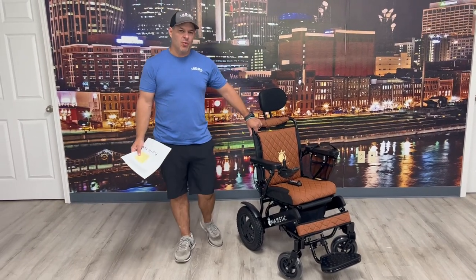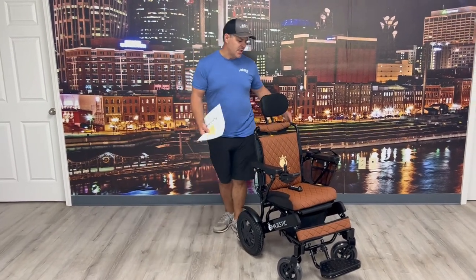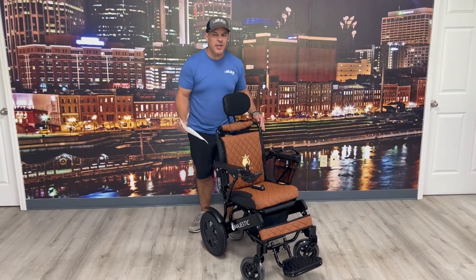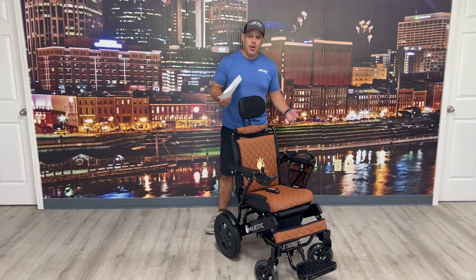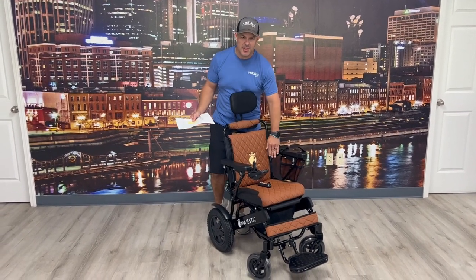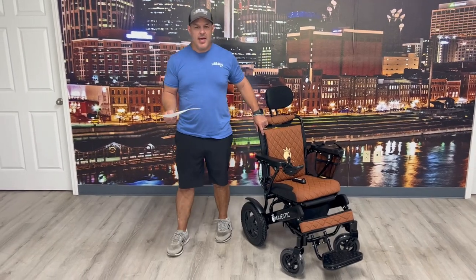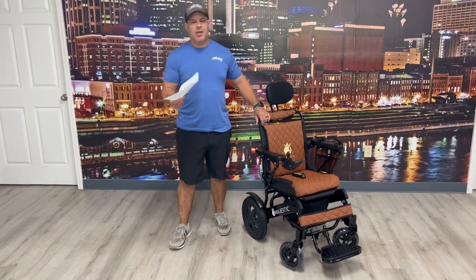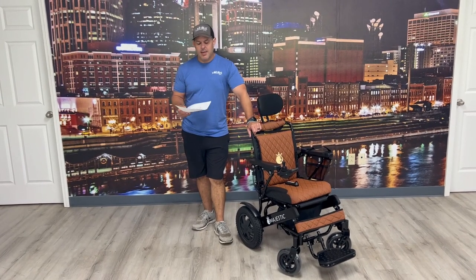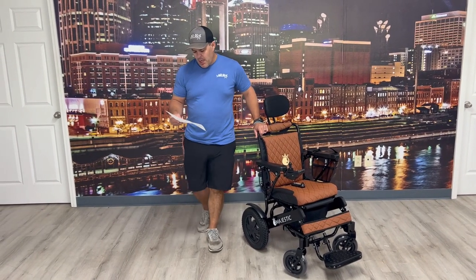The weight cap is 330 pounds. This one is a 17 and a half inch wide version; they also make one in 20 inches. I would say if you're closer to 330 pounds, you're going to want that 20 inch wide seat versus the 17 and a half inch. It is FAA approved, so you just check with your airline and let them know what make and model you have, but it is airline approved — so that's always nice.